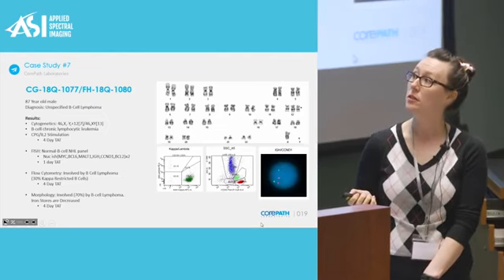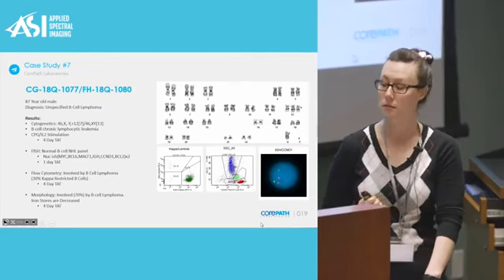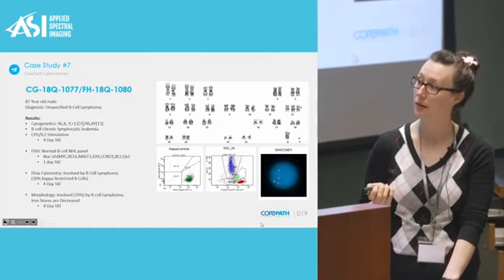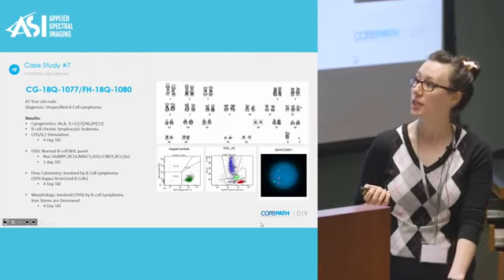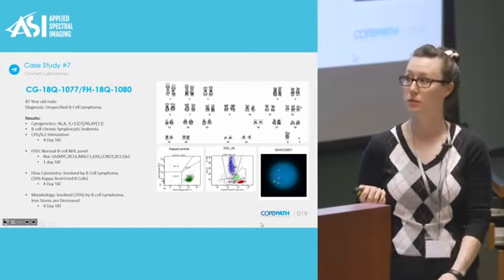So our stimulated culture showed the trisomy 12, where our unstimulated did not. And I'll touch base on that in a second. So our NHL panel for FISH, our B-cell NHL panel, was all normal. All of these probes, our MYC, our BCL6, our MALT1, our IGH, our IGH-CCND1, and our IGH-BCL2, were all normal with results in a day.